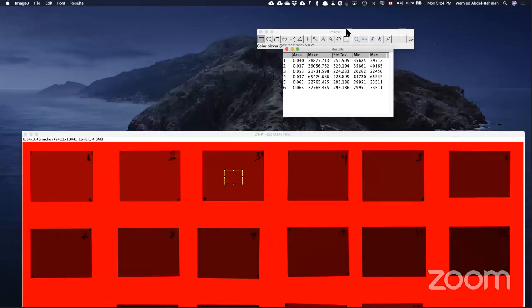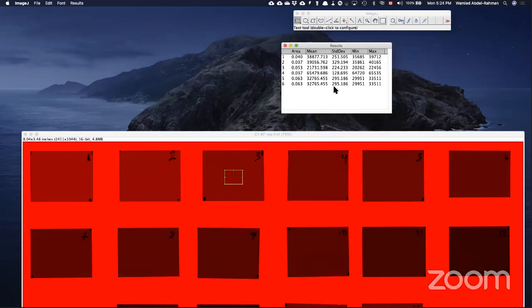So the question is basically, why don't I take this standard deviation? This standard deviation is the standard deviation of the pixel values within this region. Yes, I agree, and because there are a lot of spikes, we don't do this. We want to reduce our uncertainty. So instead, we do regions like this: region 1, 2, 3, 4, and 5, and only take the mean, the average signal. From these 5 readings, we calculate the standard deviation.